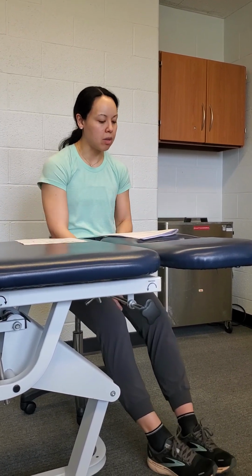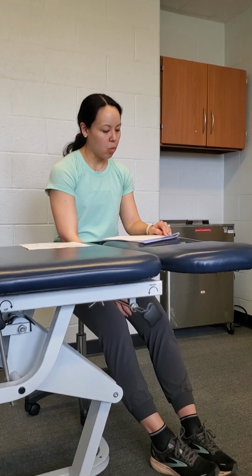Pressure setting should be based on the limb occlusion pressure. Research studies have shown that occlusion can be achieved using a lower pressure when using a limb occlusion pressure method in conjunction with a wide tourniquet cuff in adult patients. So obviously the limb occlusion pressure is individualized, but that's why the cuffs are super wide, because you want that.